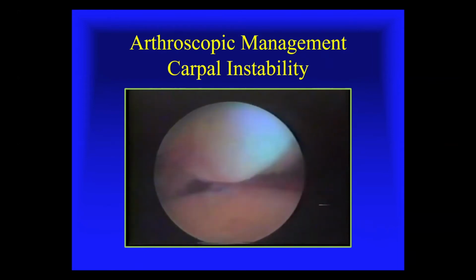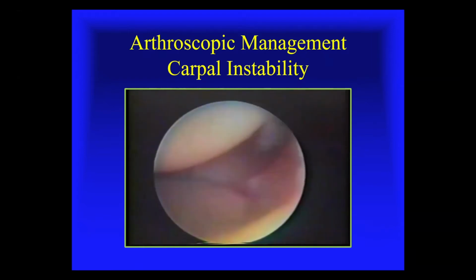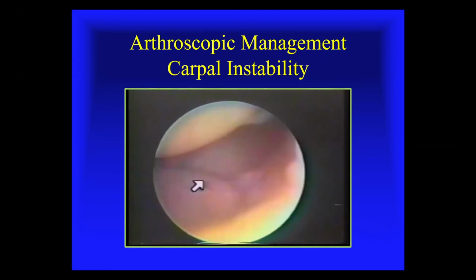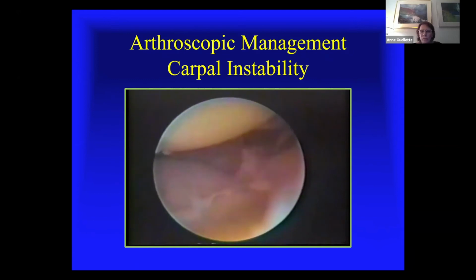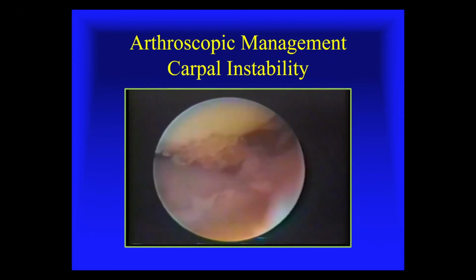Again, we see the bulging ligament as seen from the radiocarpal space. But the best place really to do reduction is with the scope in the midcarpal space. So for a scapholunate, with the scope in the ulnar midcarpal portal, we're looking across the wrist to judge rotation. We'll get an anatomic reduction, and then we'll place the guide pins across. And as you place the guide pins, you can see the fat droplets. That confirms the pins are going between the two bones.